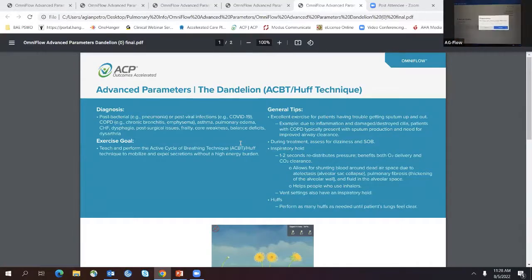I'm going to start the exercise, prep my sensor, and you'll hear that little buzzing sometimes when you're using this right next to your ear. And as the exercise queues up, again, because this is more an exhale type thing, I would very much want you to consider having a collection vessel near, towels, that kind of stuff, because it can get kind of nasty in between successful sets for clearing airway.